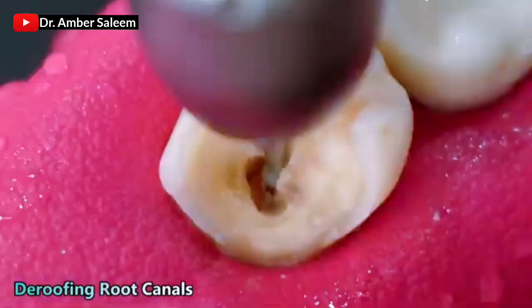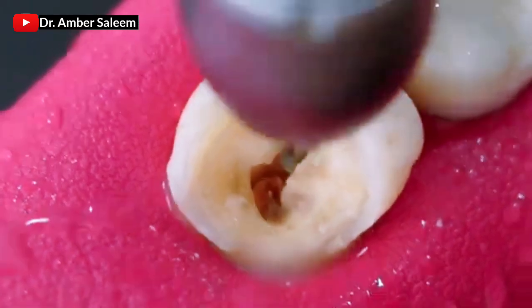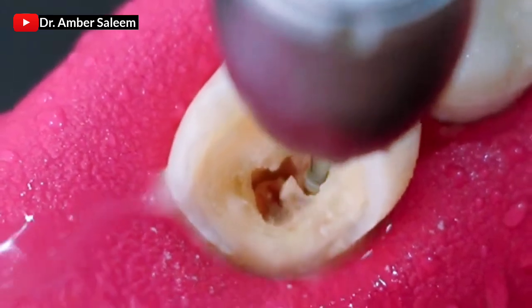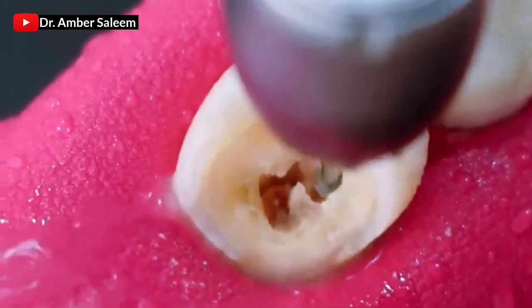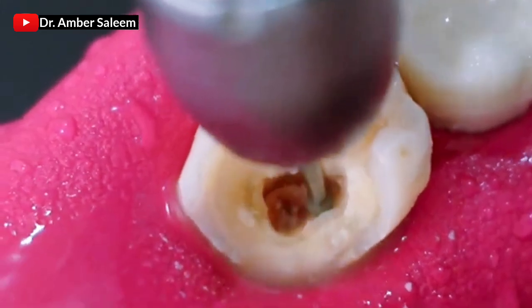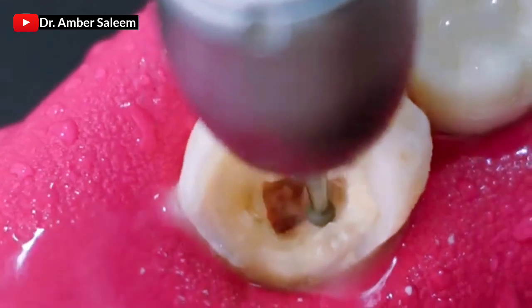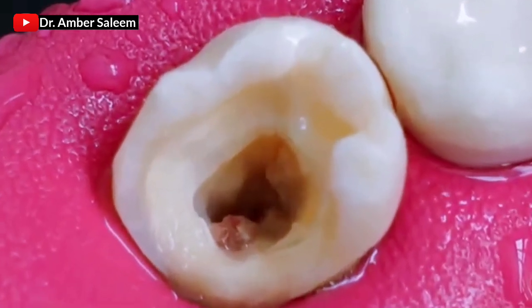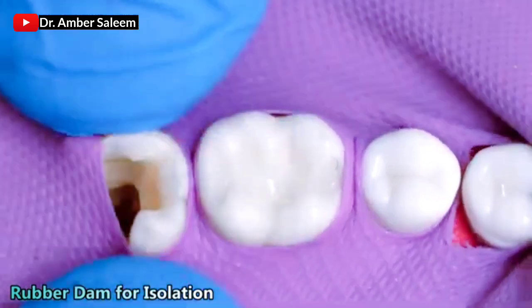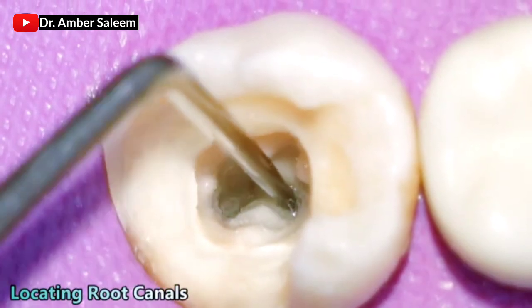Deroofing root canals. Rubber dam for isolation. Locating root canals.